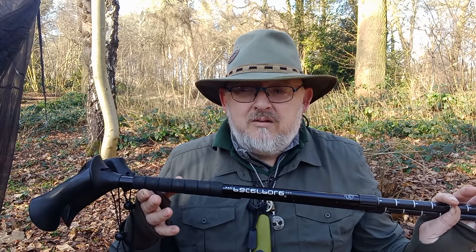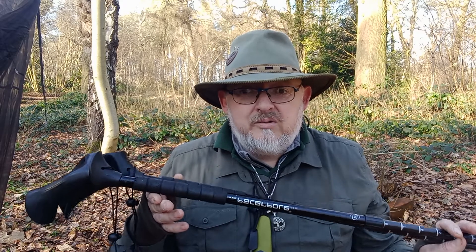If you have mobility issues and don't get on with normal walking poles, perhaps these might be the answer. If you're local to me, you're more than welcome to pop over and give these a try. That's how confident I am that these are really good. I bought these with my own money over nine years ago.